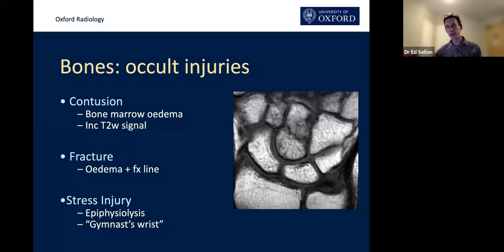What you should be doing is looking for a discernible fracture: either a straight black line on the T1 image, or less commonly on the fluid-sensitive PD fat-sat images. I look first at that coronal T1 as a screening image — it's the first image you should look at — searching for little black lines. Having not seen any, I then look at the fluid-sensitive images for areas of bone contusion, i.e. bone marrow oedema in the context of trauma. If I see focal areas of contusion, I look for an associated black line on those fluid-sensitive images. Just follow the fluid — that's the secret.